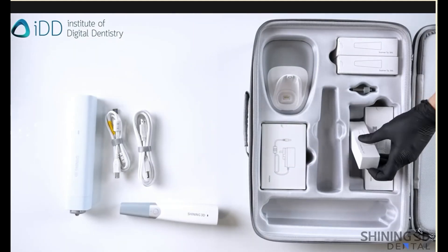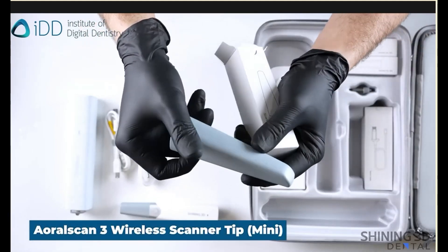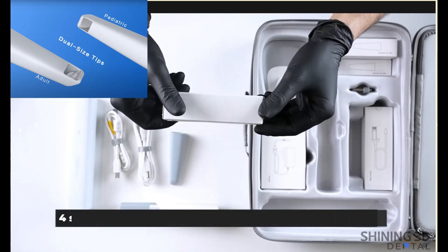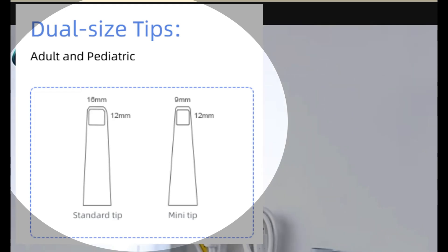Scan tips slide over the scanner wand's head and are the extensions that go intraorally to acquire the scan data. They come in two sizes, and the standard set delivered includes five tips: one smaller pediatric size tip and four larger standard units.